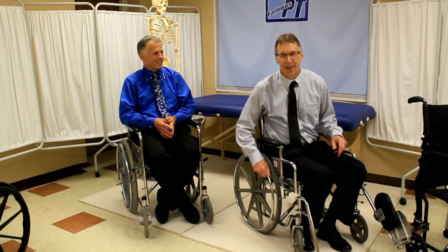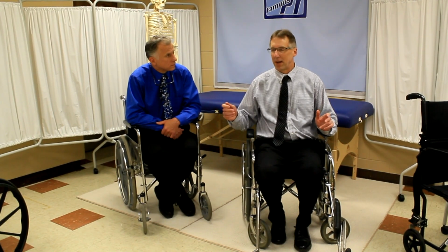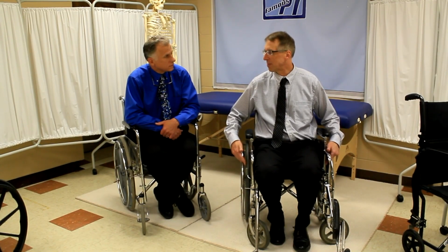So, I had one friend who was in a wheelchair, and he came in one day, and he had filled up his air at a pump outside, and the air was cold. Then he came inside, and it expanded, and both tires popped at the same time, sounding like shotguns going off, pop, pop.